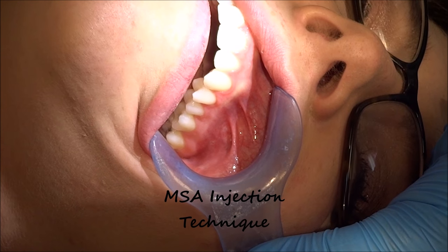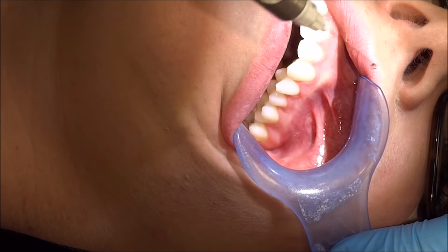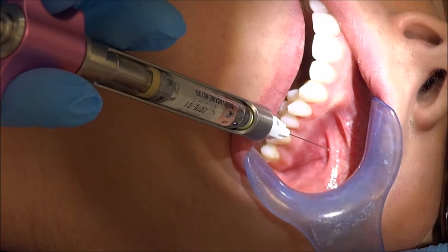An MSA injection will numb the mesial buccal root of the first molar and the two premolars. To give this injection, insert at the height of the mucobuccal fold over the second premolar.